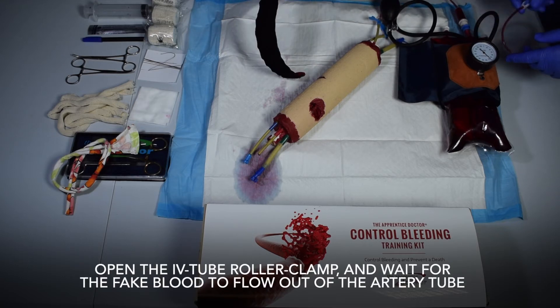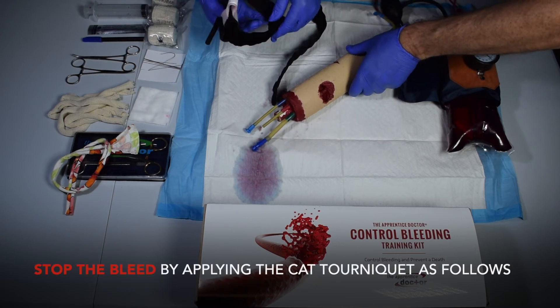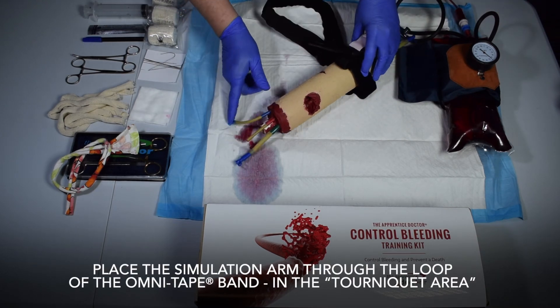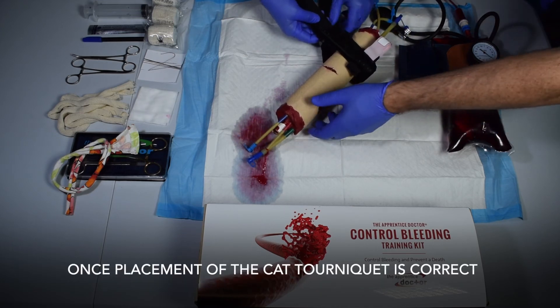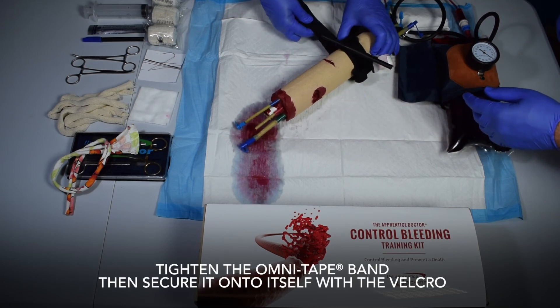Open the IV tube roller clamp and wait for the fake blood to flow out of the artery tube. Stop the bleed by applying the CAT tourniquet as follows: place the simulation arm through the loop of the omni tape band in the tourniquet area. Once placement of the CAT tourniquet is correct, tighten the omni tape band.